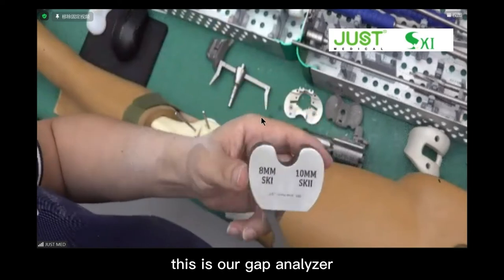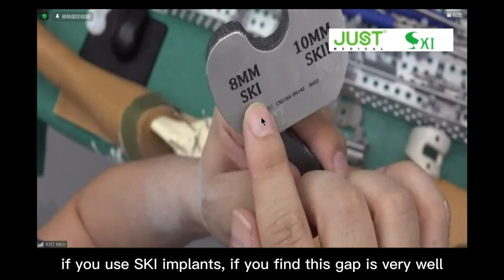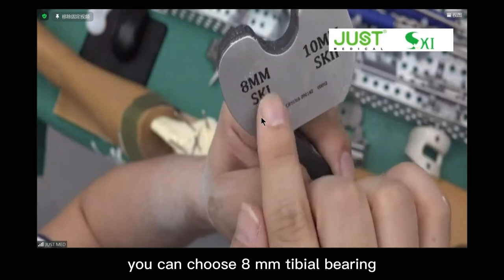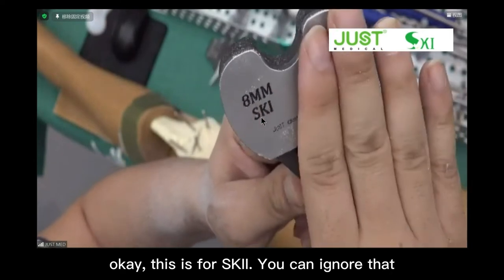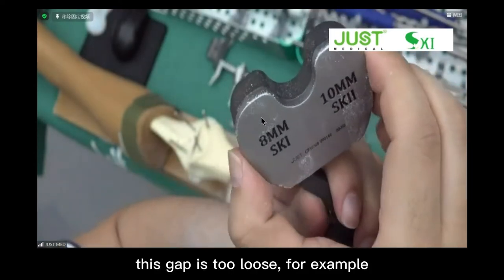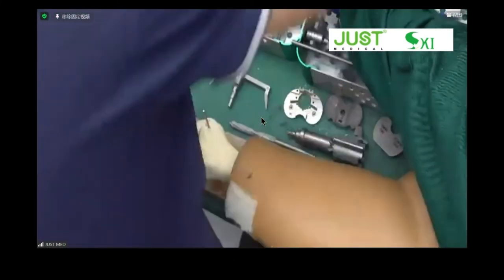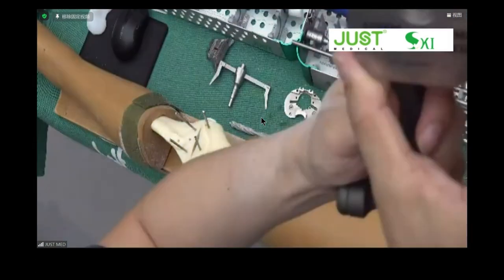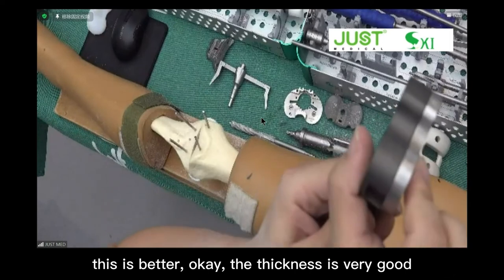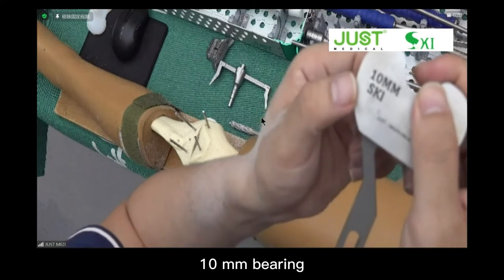This is our gap analyzer. If you use the SK1 implant and you find this gap is very good, you can choose an 8 millimeter tibial bearing. This is for SK2, you can ignore that. For example, if this 8 millimeter gap is too loose, we need a thicker one. Maybe you find this is better, the thickness is very good. Then you just choose a 10 millimeter bearing for SK1 implants.